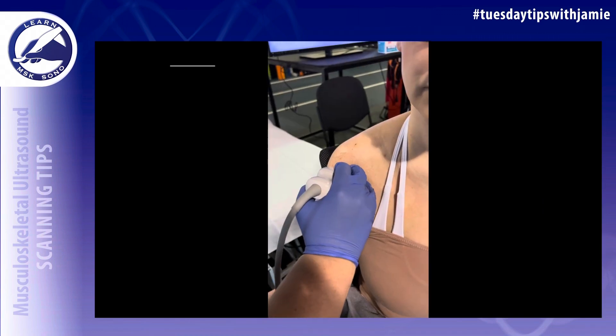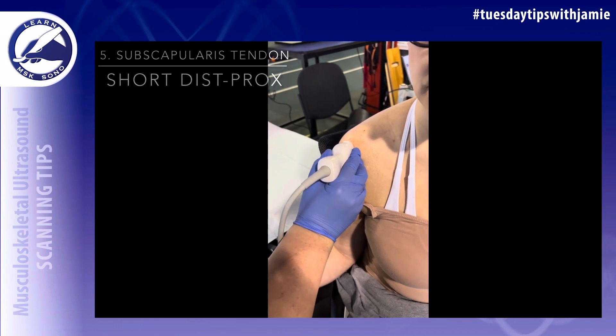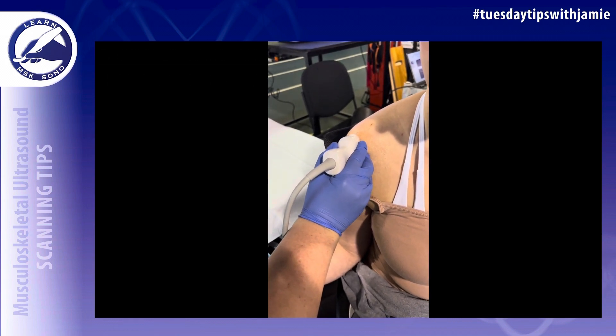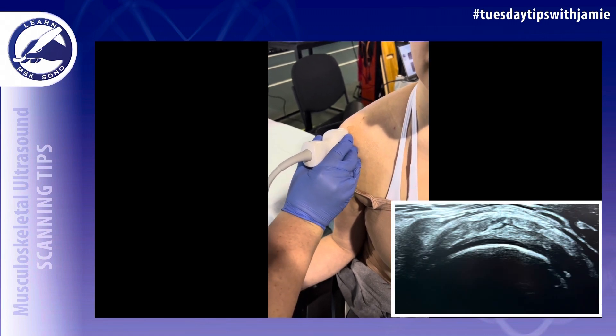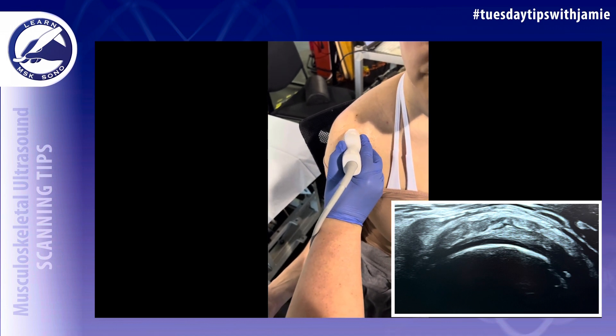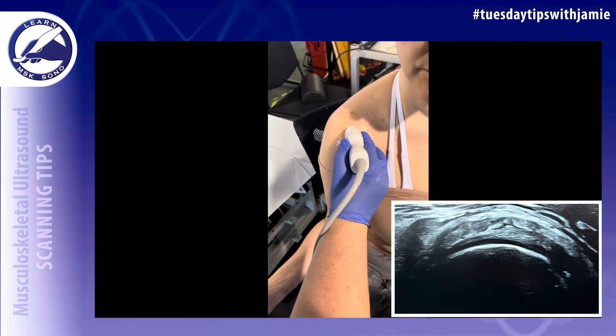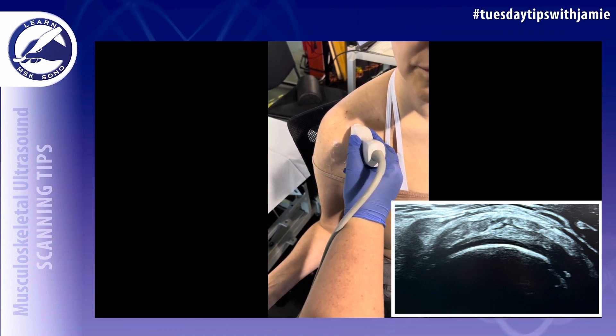Rotate the transducer 90 degrees. You'll be sagittal on the patient's body to image the subscapularis tendon in the short axis from distal to proximal — from the insertion onto the lesser tuberosity to the myotendinous junction. While scanning, tilt the probe laterally to eliminate anisotropy.